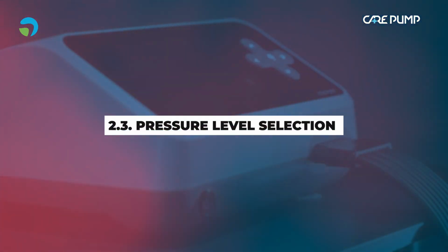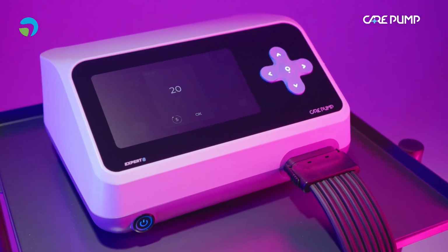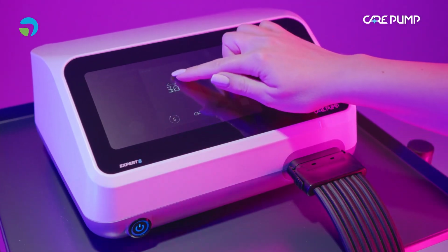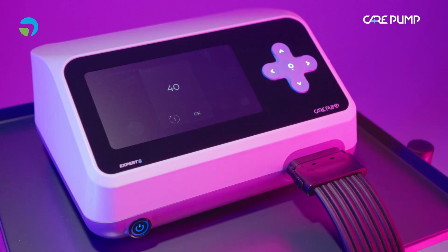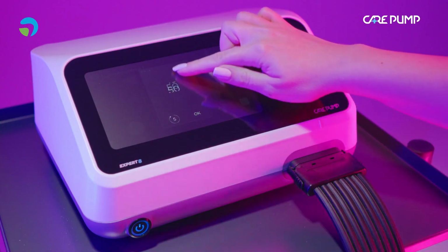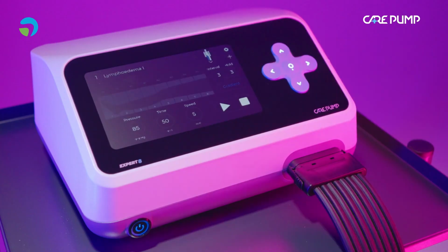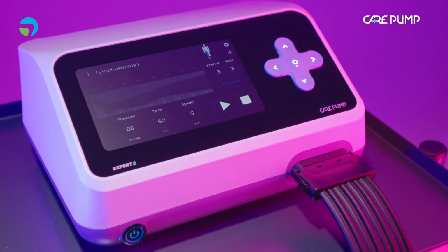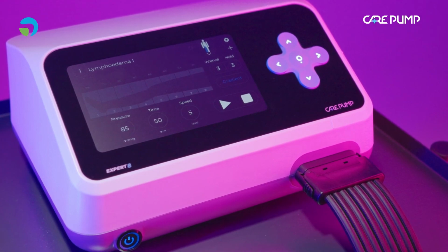Pressure level selection. Start setting the pressure by selecting the initial pressure and moving the values up and down on the list. These values can be displayed on the list every 1, 5, and 10. Confirm the selected pressure level by pressing OK. The pressure in the next chambers will be set automatically in accordance with the set gradient.